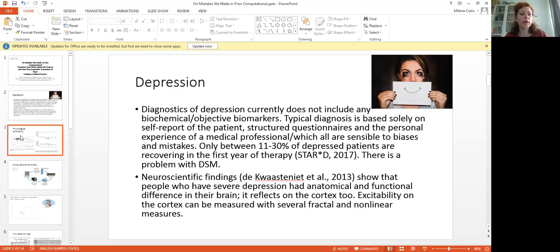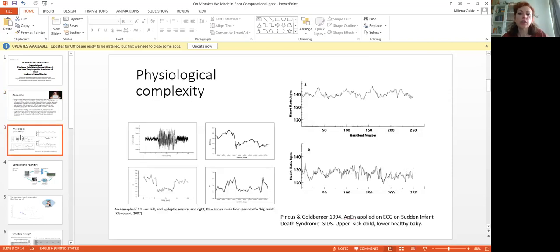So we use some nonlinear measures, which are basically coming from complex dynamic systems theory. And in this research that we are comparing with others, we are using Higuchi fractal dimension with sample entropy, and you have some examples on screen. For example, fractal dimension on the left of an epileptic focus is showing that fractal dimension drastically dropped during the onset.